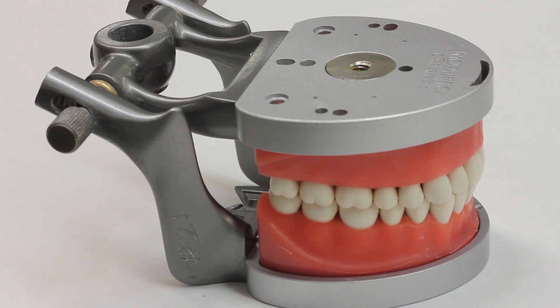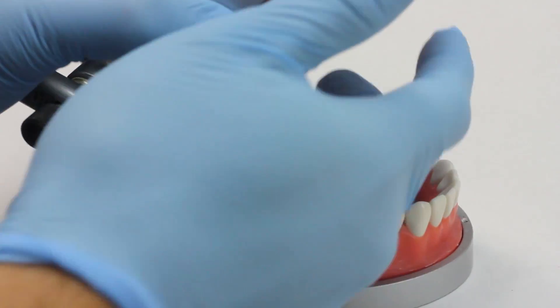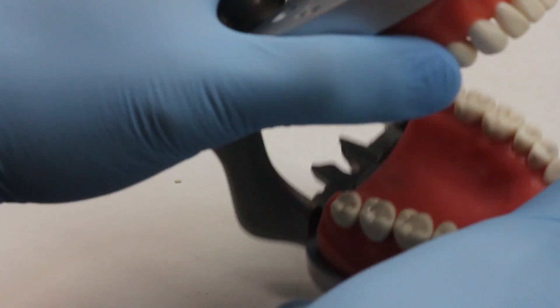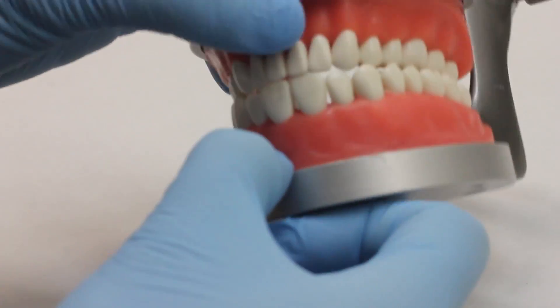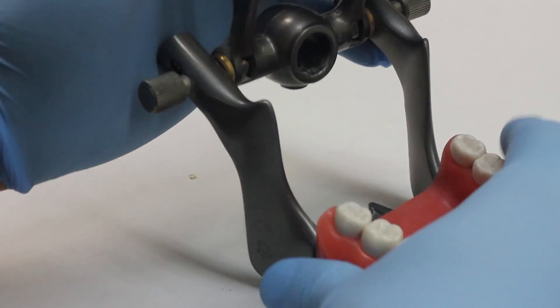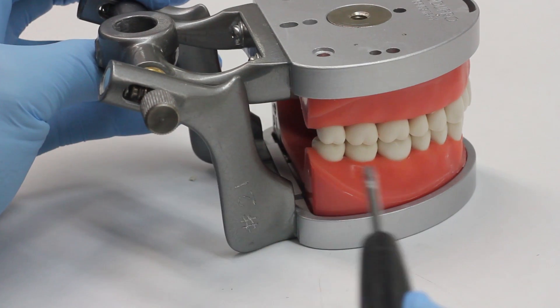We're going to show you how to calibrate your typodonts today. A couple things to note about your articulator before we get started: make sure that your teeth are mounted on the appropriate arch. Sometimes the lower and upper get reversed. Make sure your maxillary teeth go on the maxillary arch and the mandibular teeth go on the mandibular arch, and you can tell that by the location of the hinge.